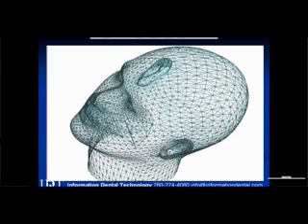If you have a patient that doesn't have a lot of restorations, we can scan the patient and then you send us the model, and we can do an STL of the model, merge those together, and then create a surgical guide based off of that model and off of STL technology. It's going to be more accurate because you don't have those threshold levels that you're setting. So it's a good technology to use.